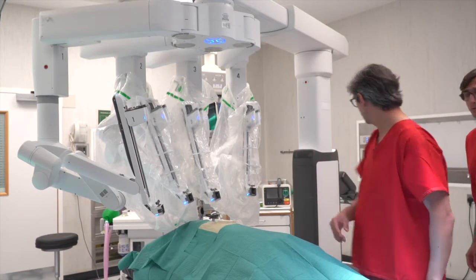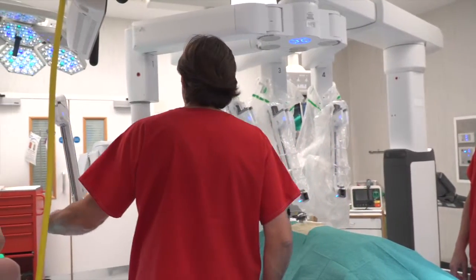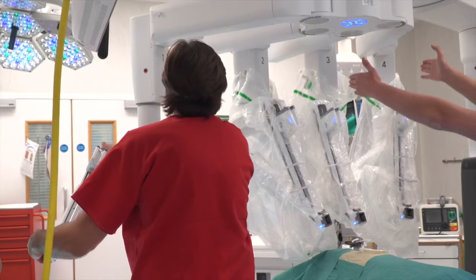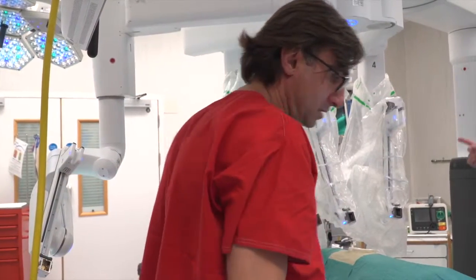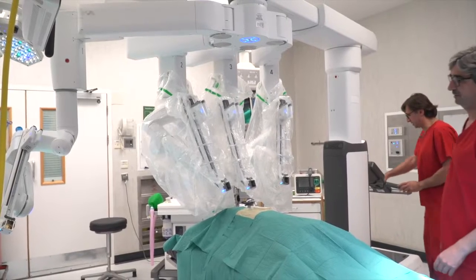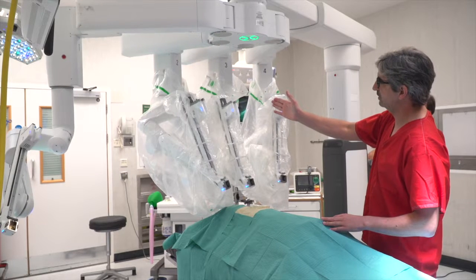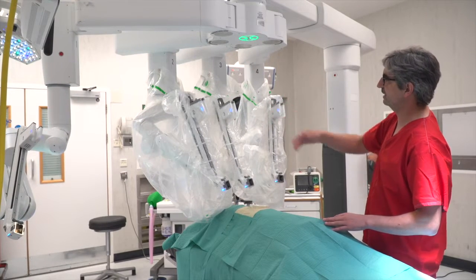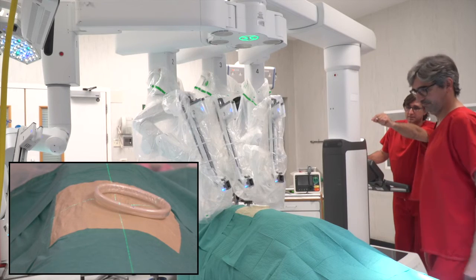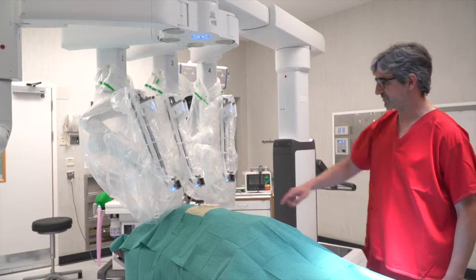Now, Mugur, we will cancel arm one for the right side. We cancel the arm because the line must be parallel with the patient. A little bit more rotation here. You see the line — the long line must be parallel with the table. The cross at the upper part of the incision and the line parallel with the patient. More or less parallel, this line.